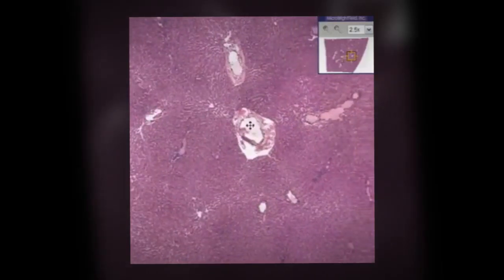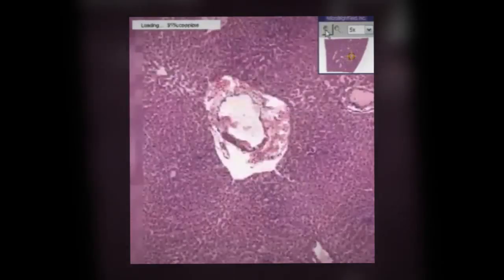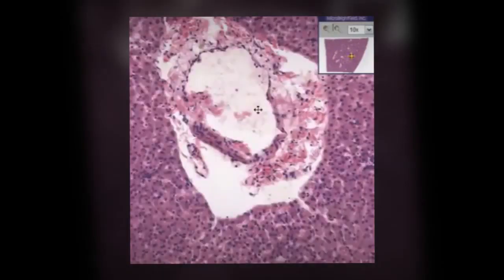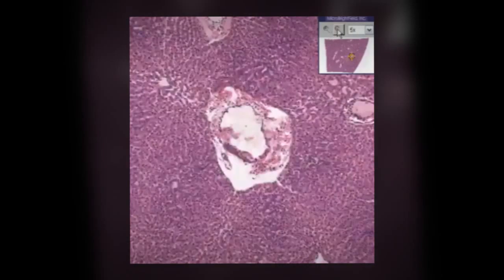But if you see something that basically doesn't have much connective tissue and looks big, and it's really only a vein, then that's more likely to be a hepatic vein. But once again, if you take a look and there's a little bile duct in the corner somewhere, then I would like to change my theory and probably call it a portal vein.